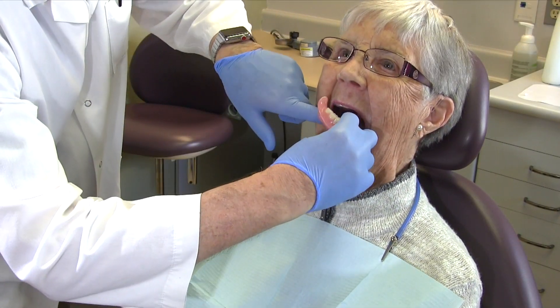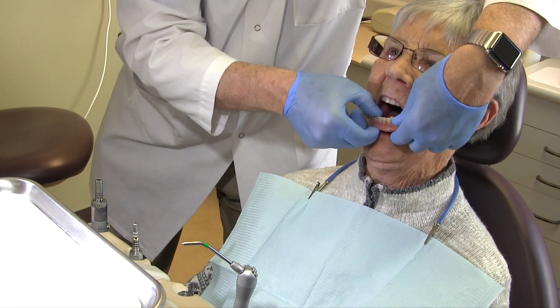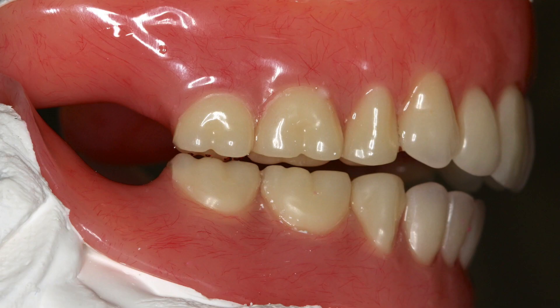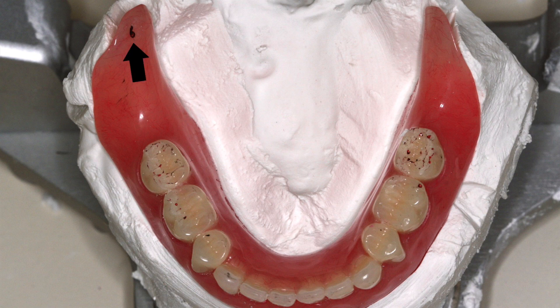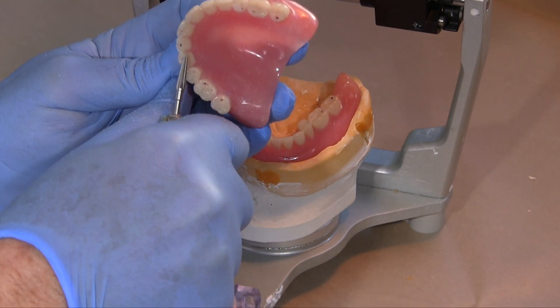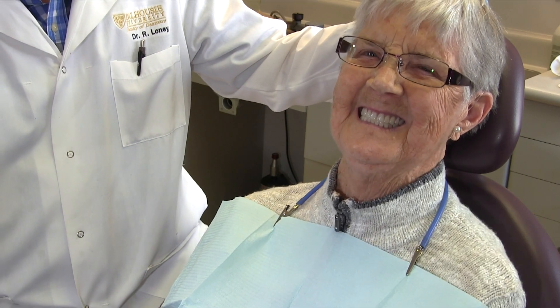They stop moving towards interferences when things become uncomfortable, with the consequence being that the clinician is unable to identify the full extent of the occlusal problem. Thirdly, remounting reduces the time required for the repetitive insertion and removal of dentures associated with intraoral adjustments. It allows for better visualization of problems extraorally. For instance, unintentional contacts between maxillary and mandibular denture bases in excursions can be very destabilizing and are much easier to identify on an articulator. Lastly, it is often possible to adjust dentures sufficiently to minimize subsequent repeat adjustment appointments. Time is saved and patient satisfaction is improved.